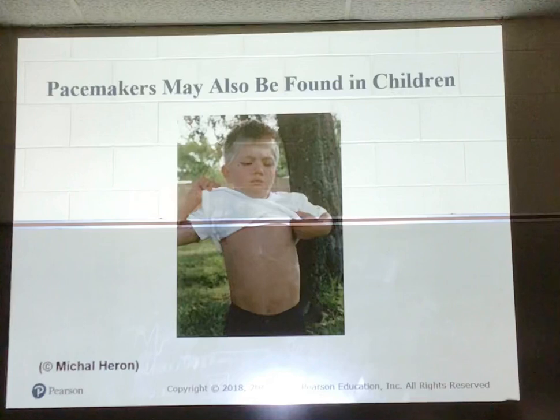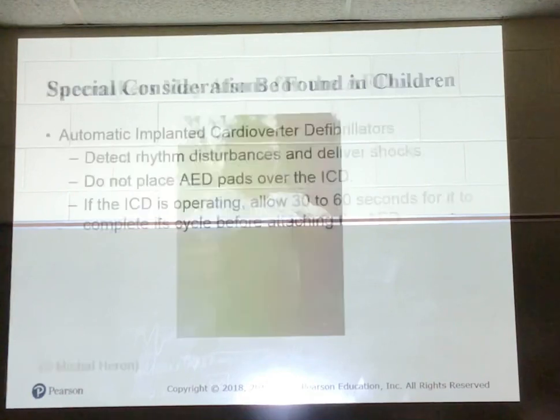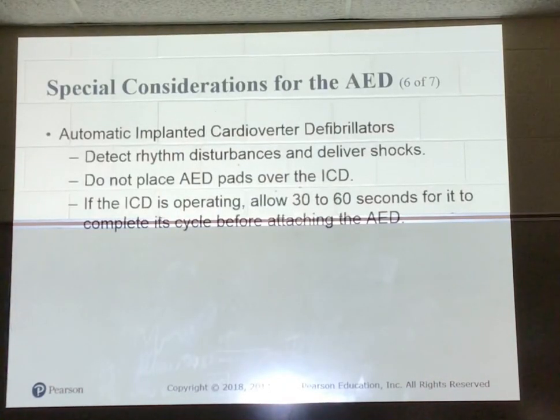All right. You can also find pacemakers in kids. Automatic implanted cardioverter defibrillators detect rhythm disturbances and deliver shocks. Do not place the AED pads over these. They'd be in the same place as the pacemaker. Okay.